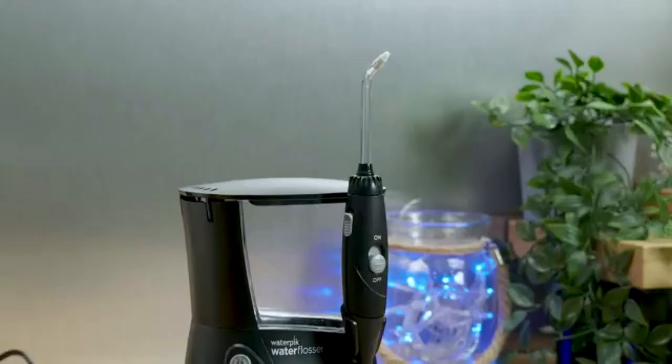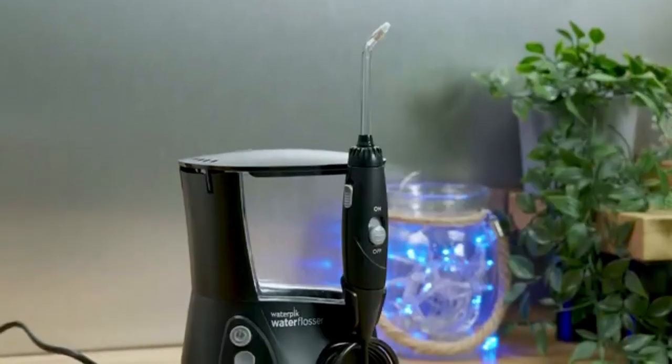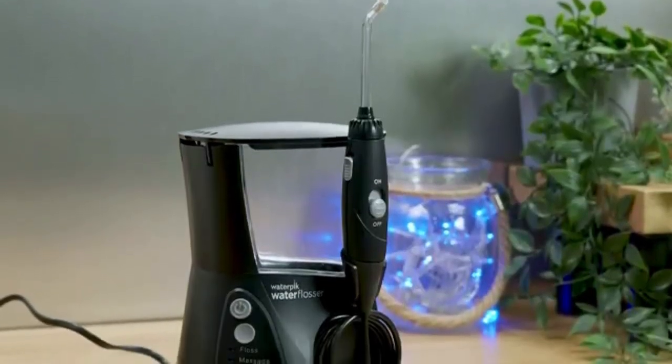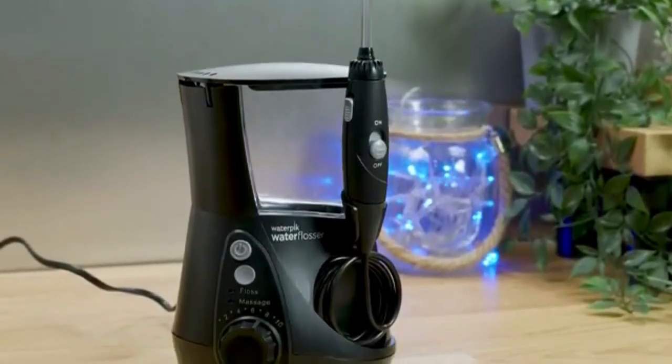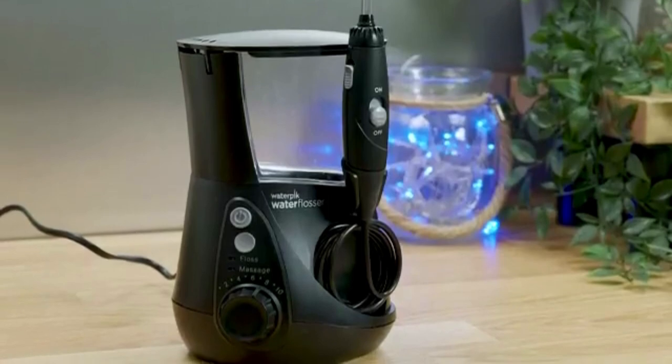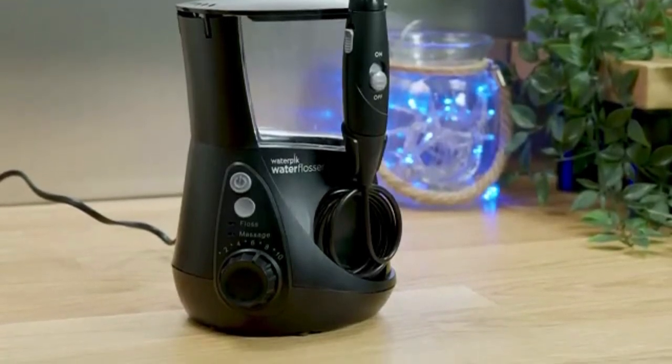Hey, it's John from Electric Teeth here. Over the years I have tested many water flossers, both corded and cordless. There is a lot of choice on the market today, and whilst there are many brands and models that are extremely cost effective, they don't always deliver the overall value for money you get with a brand leader like Waterpik.